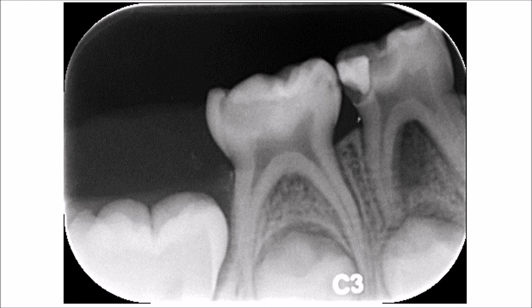Don't assume that the pulp is exposed in this lesion. This is a 2D radiograph, and the final confirmation of pulp exposure should be done after careful clinical examination.